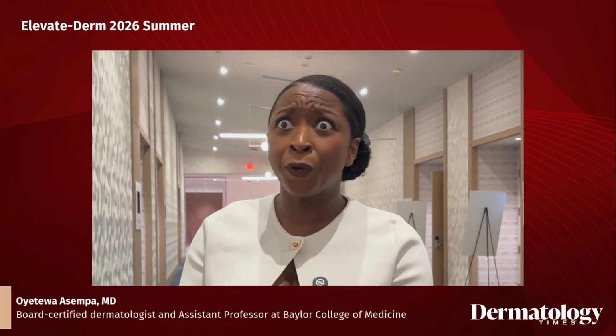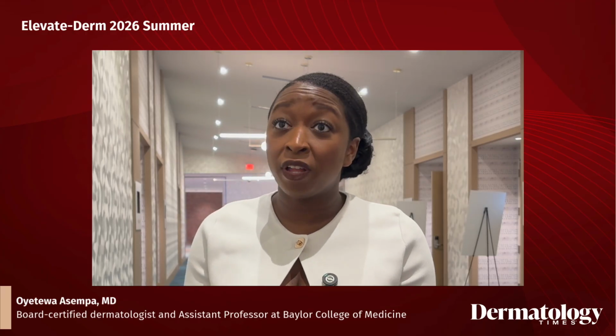I actually think that most people aren't doing it because they just don't know, am I going to mess up the style? But if a patient has come to you for hair loss, they are expecting you to get in there. And if they weren't expecting it, then you should tell them, hey, I think we should have you come back with your hair loose and ready for me, right?